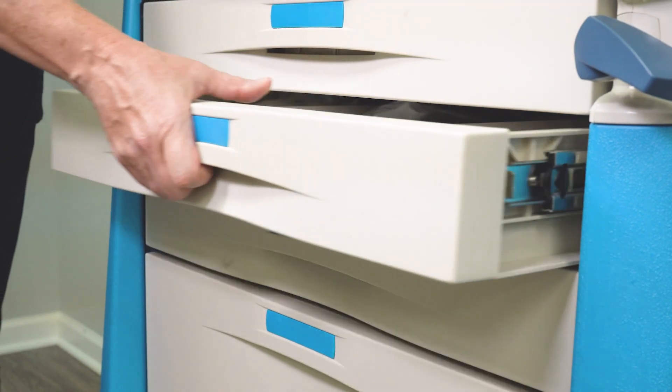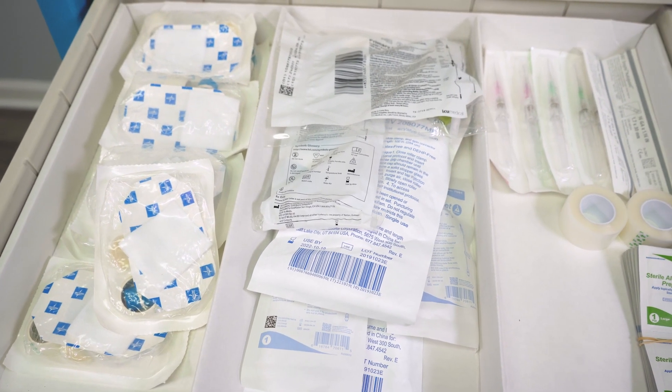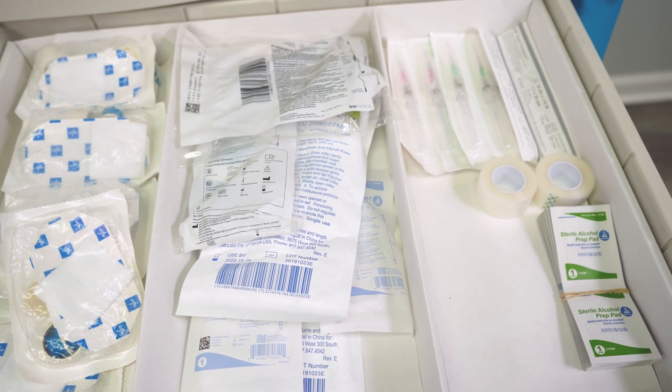The second drawer contains safety IV catheters with supplies to start an IV and administer IV fluids. Baxter, Alaris and Plum Pump IV tubing sets are included for safe administration of oxytocin.